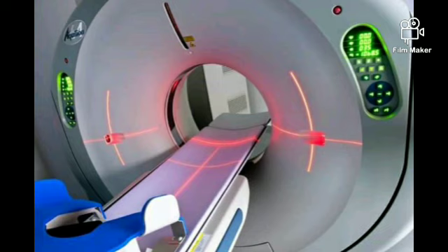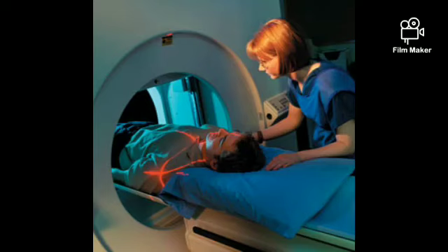Also the inner first line of reference is known as the first reference line, and the second one is known as the second reference line. These two lines are very helpful whether you want to work in the in direction or the out direction. If you are positioning at the second reference line, that is your out direction, and if you are positioning at the first reference line, that is your in direction. So that is how you have seen the positioning done.